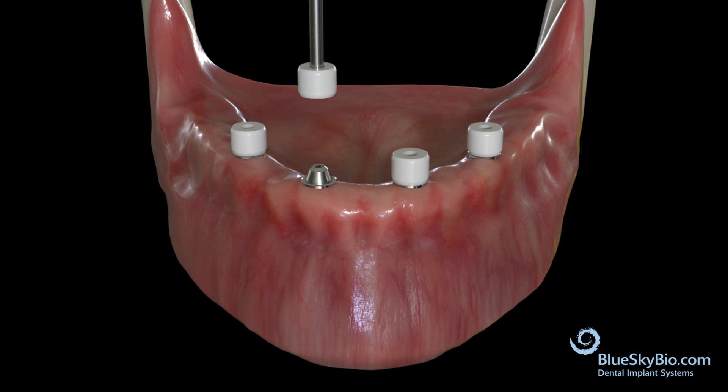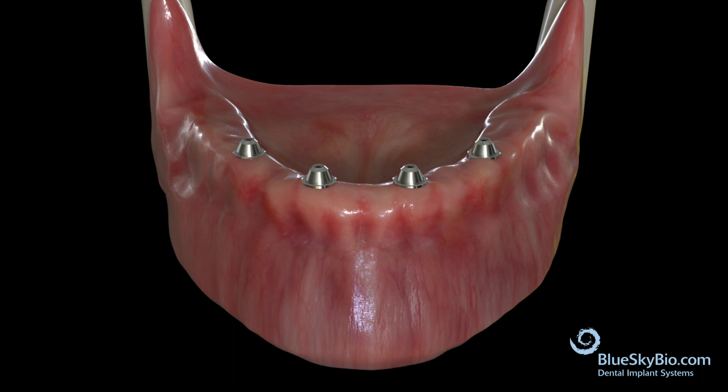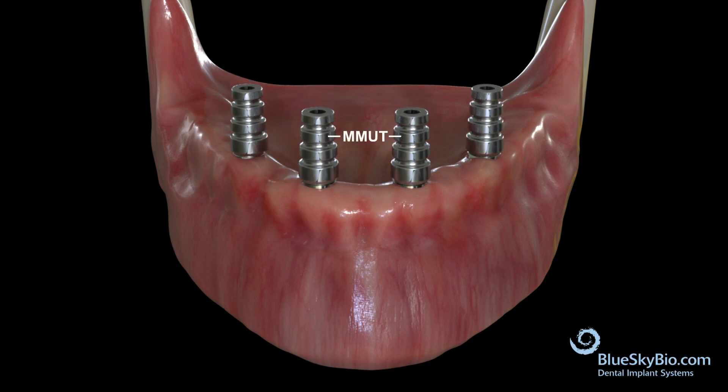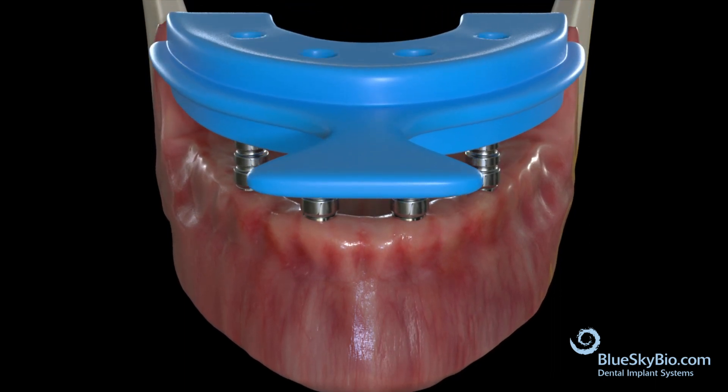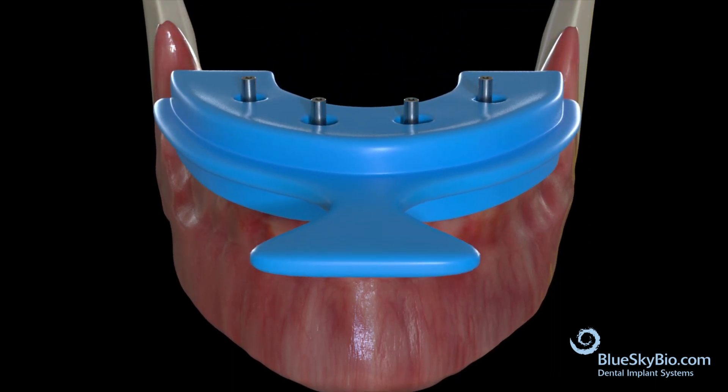Remove the comfort caps or the immediate load restoration and attach the metal impression transfers using the long multi-unit abutment screws. Create holes in the impression tray over each implant so that an open tray impression can be taken.